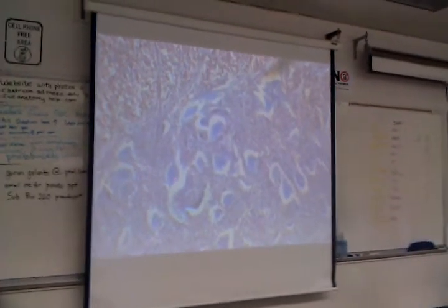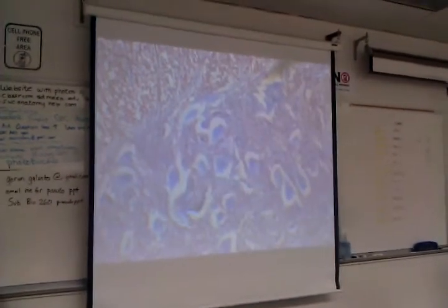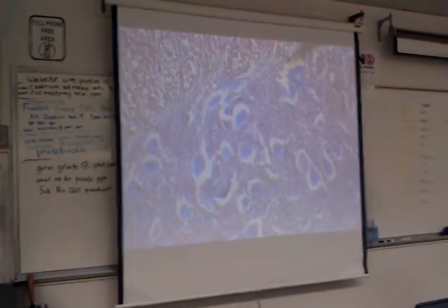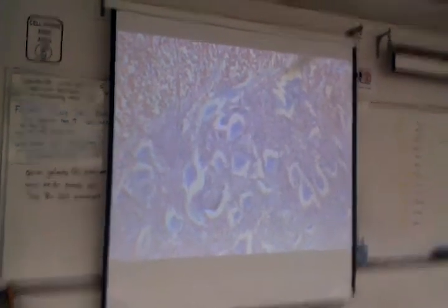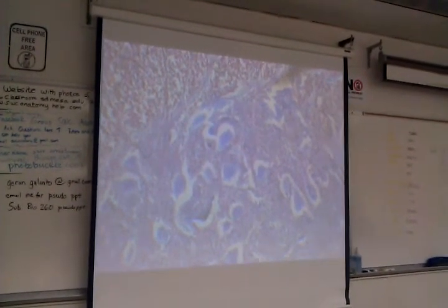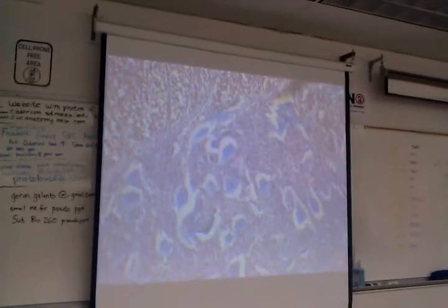So these guys, let's say you just wiped out all of these neurons right in this area. Well, you probably wouldn't be paralyzed or anything like that, but you'd probably lose some motor control somewhere, right? Because these are sending out their impulses to muscles. So anyway, this is in the anterior, or well, I keep saying anterior. I guess I should say ventral gray horn.